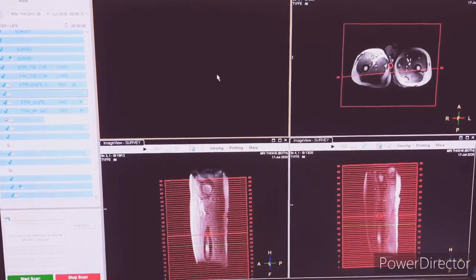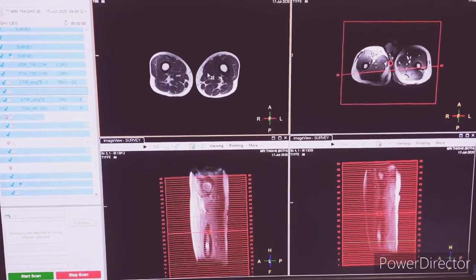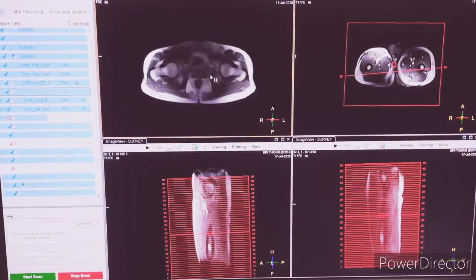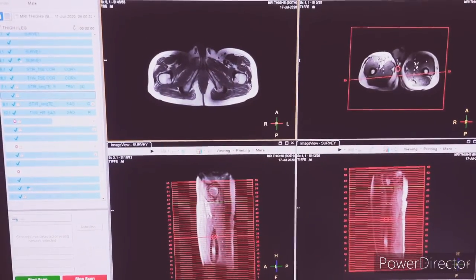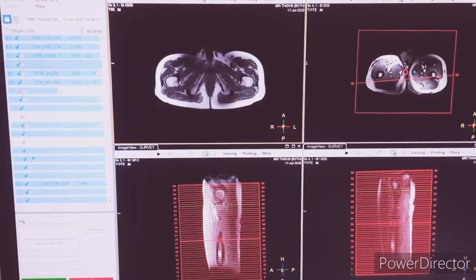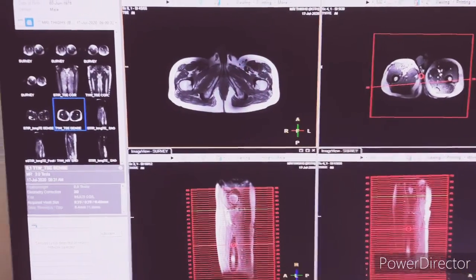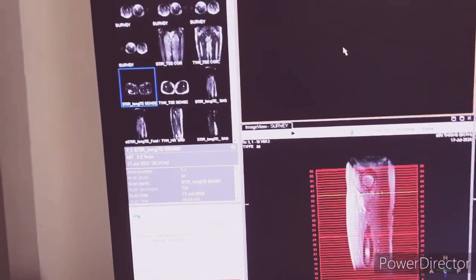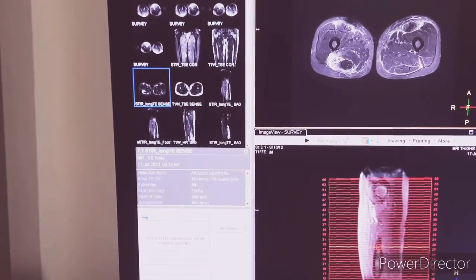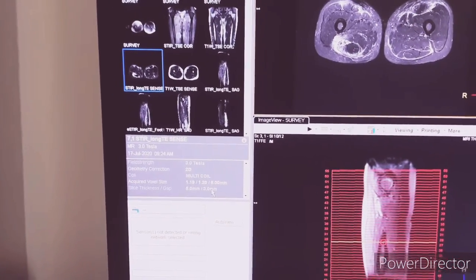Next is T1 axial. Again, the planning is the same as STIRCOR. You have to keep it the same as STIRCOR. You can see the number of slices here — the slice thickness also. Slice thickness we have kept at 5mm and gap is 3mm.